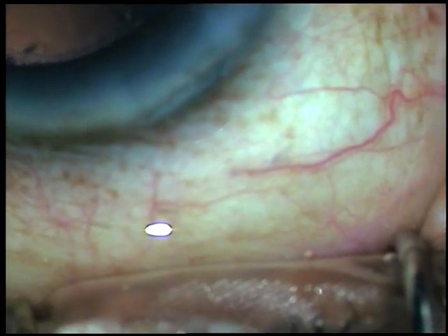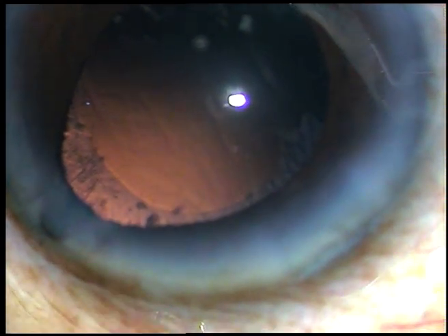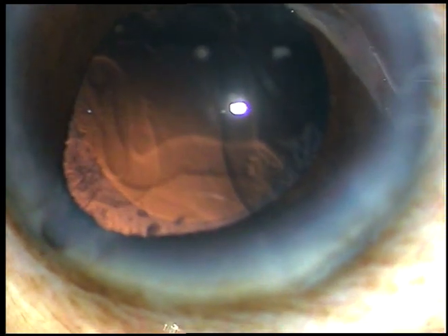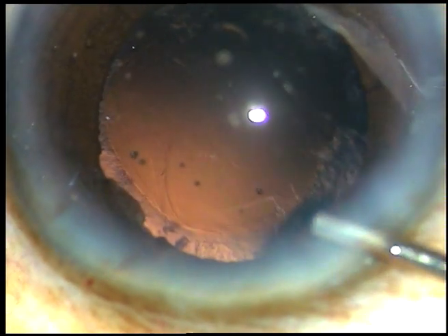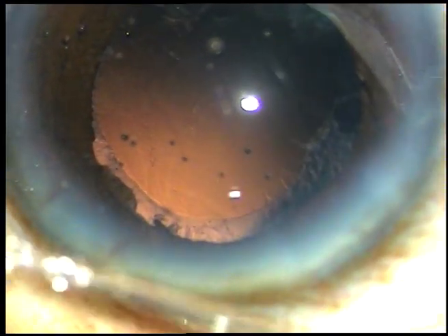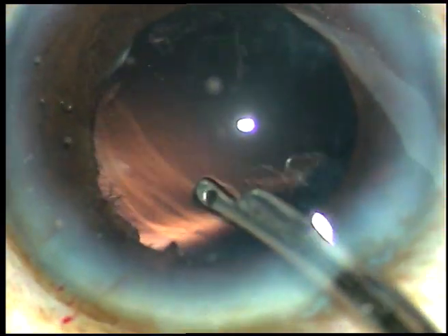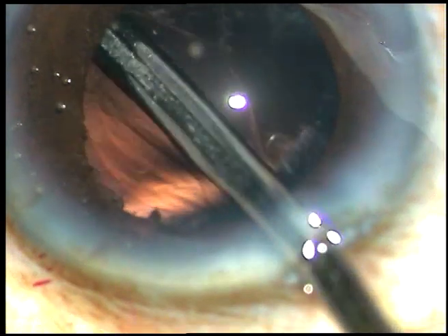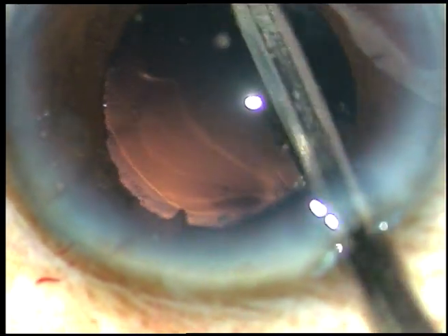Whenever there is iris prolapse through the side port, I don't remove the chopper, because the iris plugs the wound. If I try to remove the chopper, I can cause iris injury. So I remove the phaco handpiece first, let the IOP go down, and then remove the chopper. The nucleus has been nicely managed in this case.